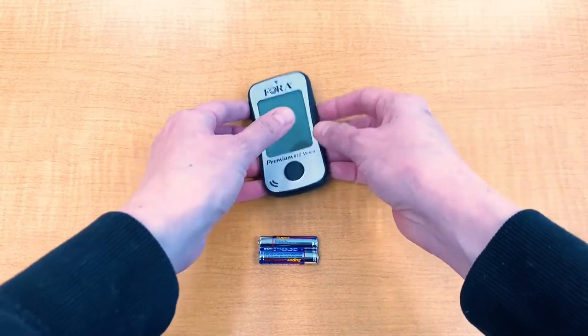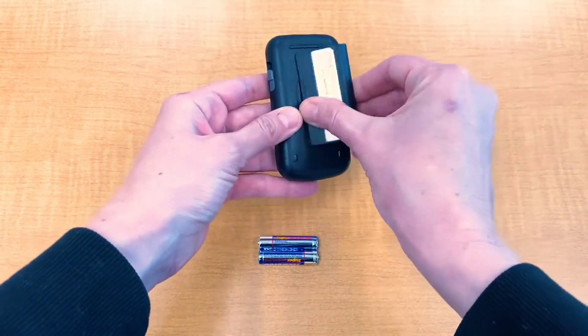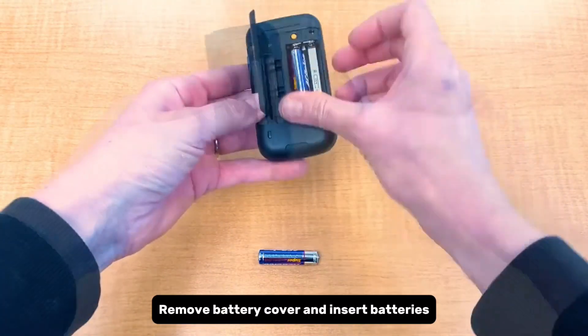Setting up the meter. Remove the battery cover and insert batteries.